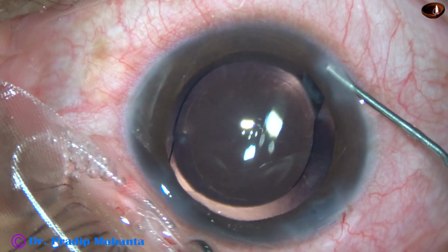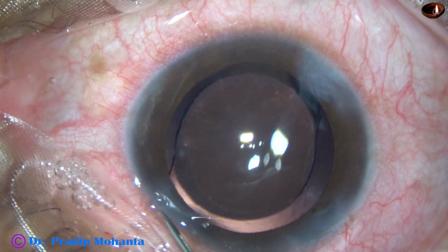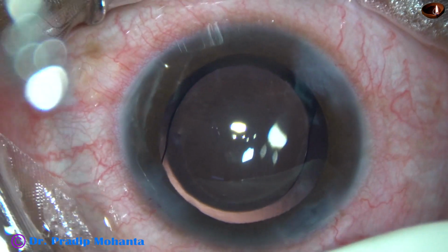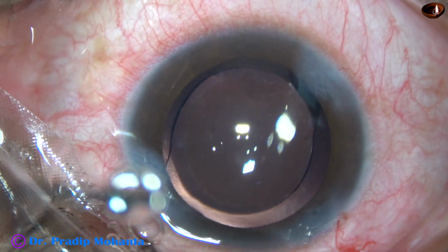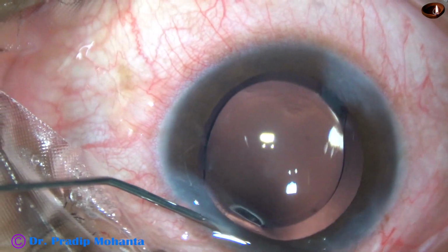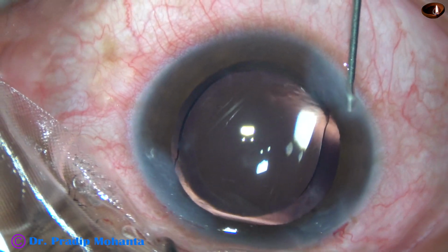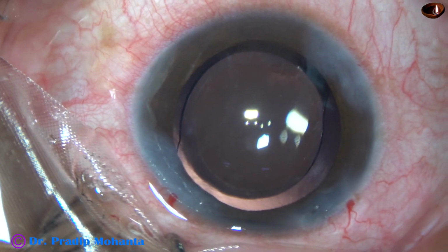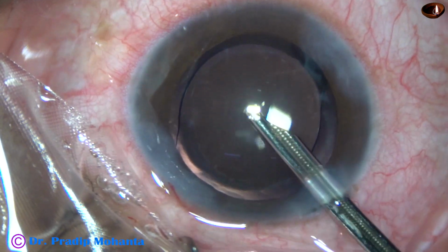We must dislodge the cells on the posterior capsule, irrigate and aspirate, do it in the capsular vacuum mode of the phaco machine. We must remove the visco very cleanly, very nicely. If we have used visco for implantation of the intraocular lens, we must dedicate some quality time for the patient to do a nice surgery. You cannot just hurry up.